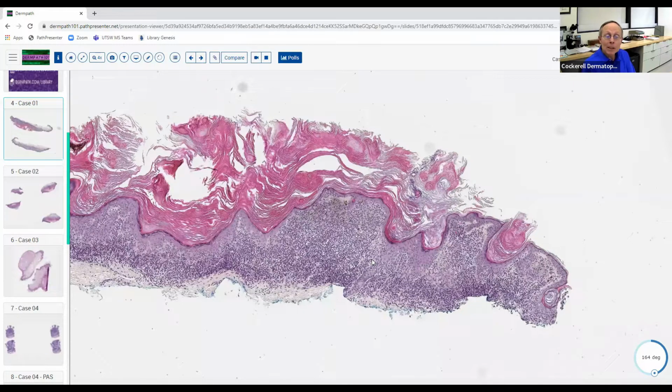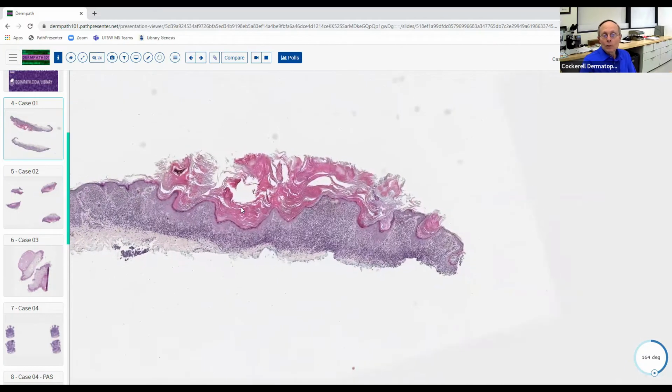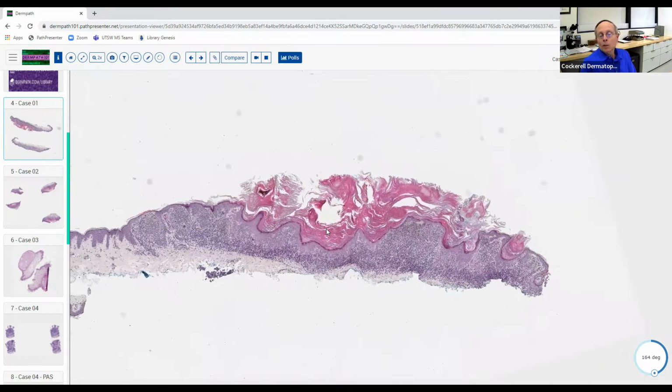Sometimes they can have a lot of inflammation and no halo. Sometimes they can have almost no inflammation and have a pretty significant halo. I don't know why that is, but it breaks the rule. And if you get a completely regressed halo nevus, it pretty much looks like vitiligo. Let's say all the nevus cells are gone and there's just a little bit of residual inflammation. If you stain for melanin and melanocytes, the melanocytes in the epidermis will be completely gone. So if that's ever on a board question, the melanocytes in the epidermis in a completely regressed halo nevus are absent. There's nothing left there.